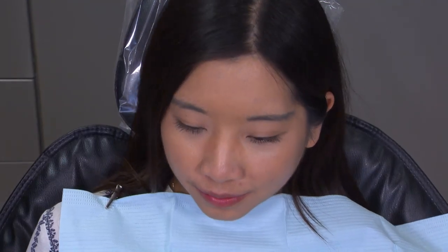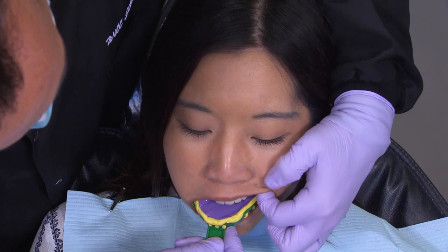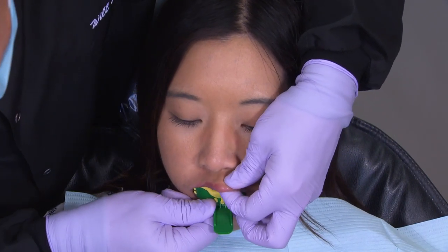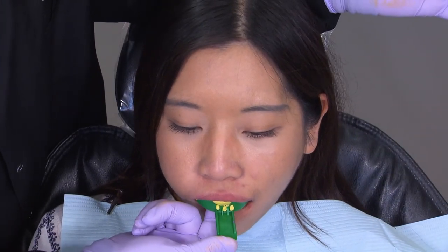I'm asking this patient to lean their head forward just to prevent this material from going down their throat. Re-seat the tray with hand pressure only, palpate the cheeks and lips to remove air bubbles and voids, and then hold the tray, continuing with hand pressure only, until the impression has set and may be removed.